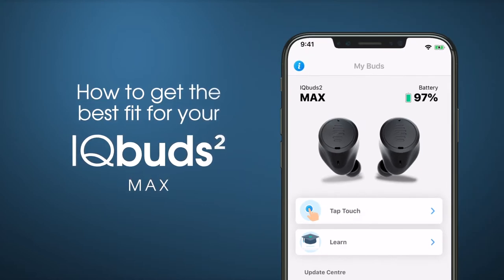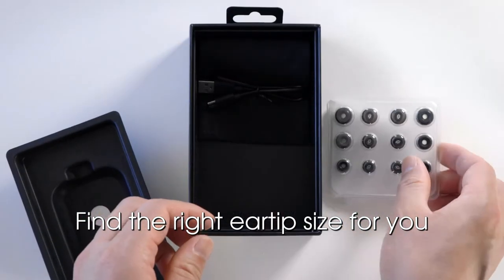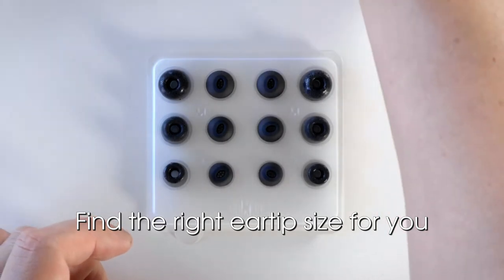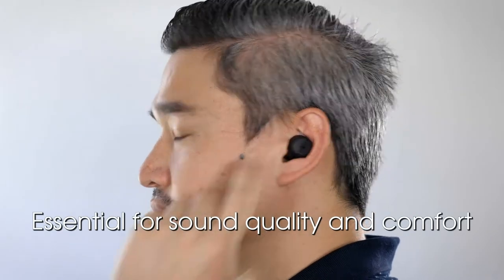How to get the best fit for your IQbuds 2 Max. Before you start using your IQbuds, you must ensure you find the right ear tip size for you to achieve the best possible fit for your ears. This is essential for sound quality and comfort.